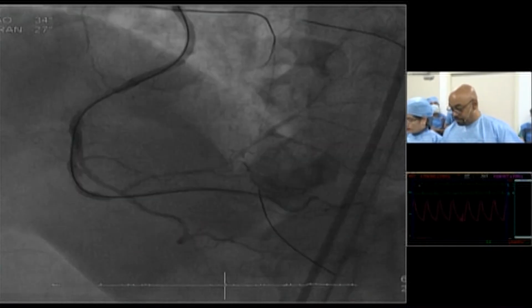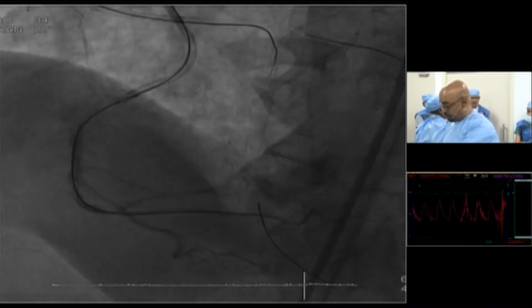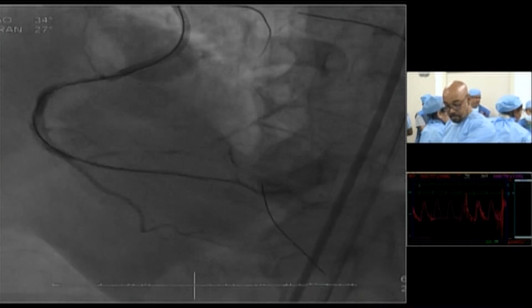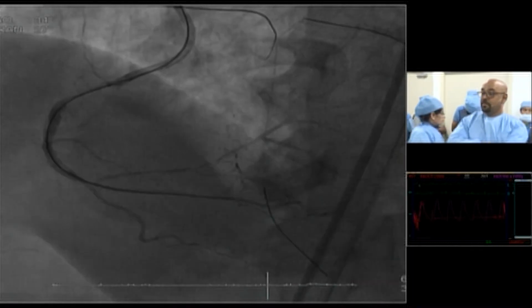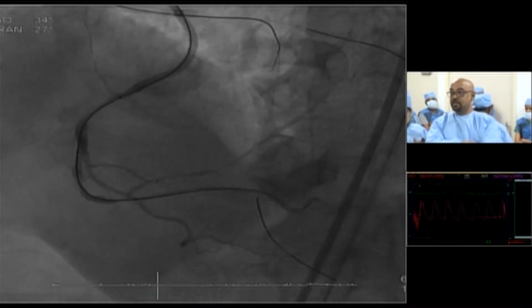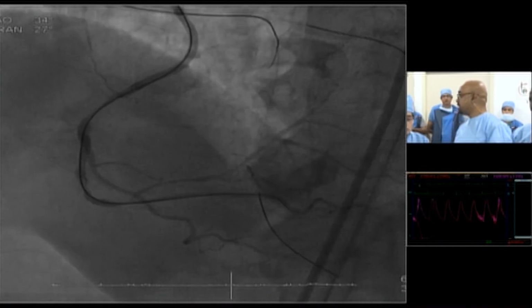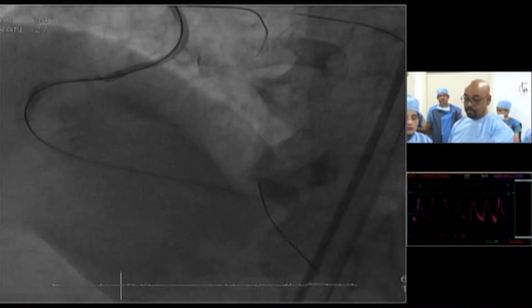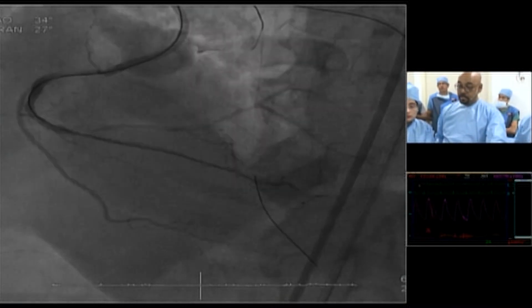But I agree. I would stent that, and then hopefully you can avoid going across that PL, right? Because it gets very small and diffuse down there. Exactly. Distal RCA also seems to be diseased. I'm trying to see where there is no disease, actually. Yeah. That's why I would probably just land in that aneurysmal segment or that big segment proximal to the PDA, PL. I agree. So we have given 100 micrograms of nitro into the RCA.